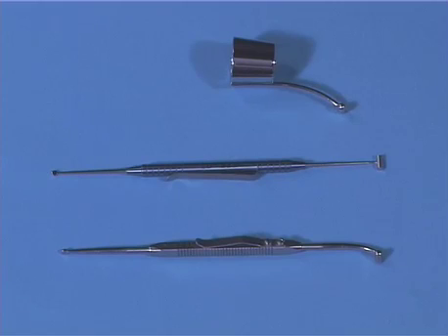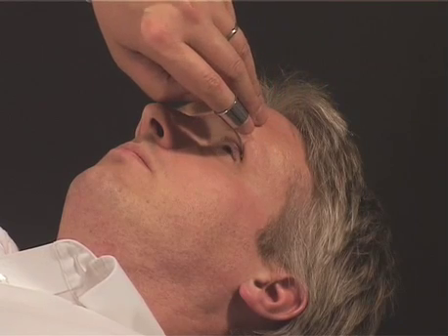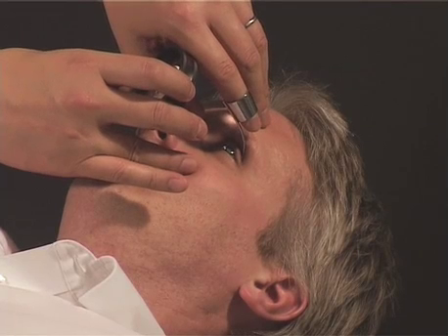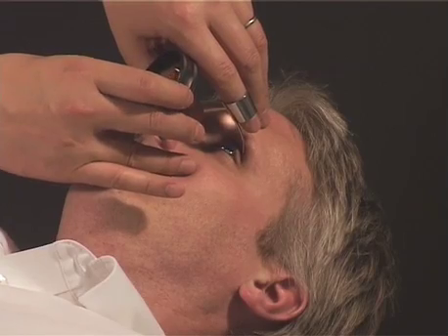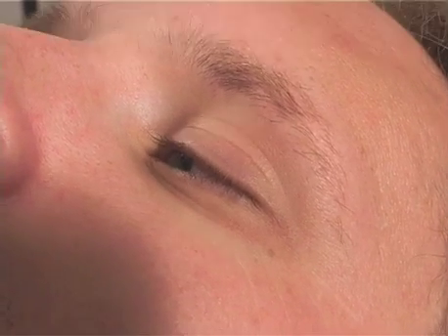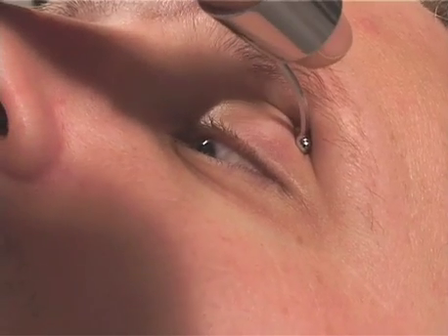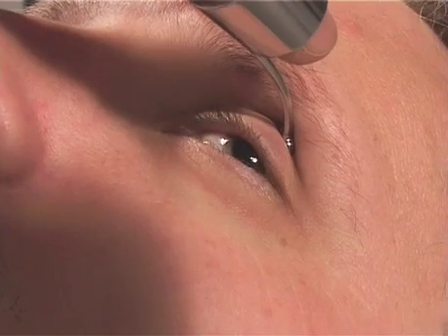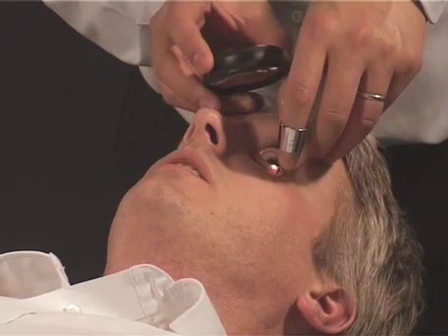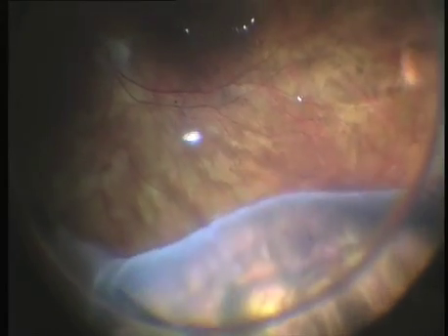Scleral indentation is an important technique for examination of the peripheral retina and one that, although uncomfortable, needn't be too unpleasant for the patient. The two key principles to observe are the appropriate placement of your indenter and to indent in the correct direction. First ask the patient to look in the direction of gaze opposite to the area you want to indent. Then place the indenter in the skin crease and gently slide it backwards over the globe. Whilst holding it in place, ask the patient to switch their gaze back towards the indenter, enabling it to nestle into position. Once in place, apply only gentle pressure on the sclera to indent it sufficiently to view the anterior retina up to the ora serrata.